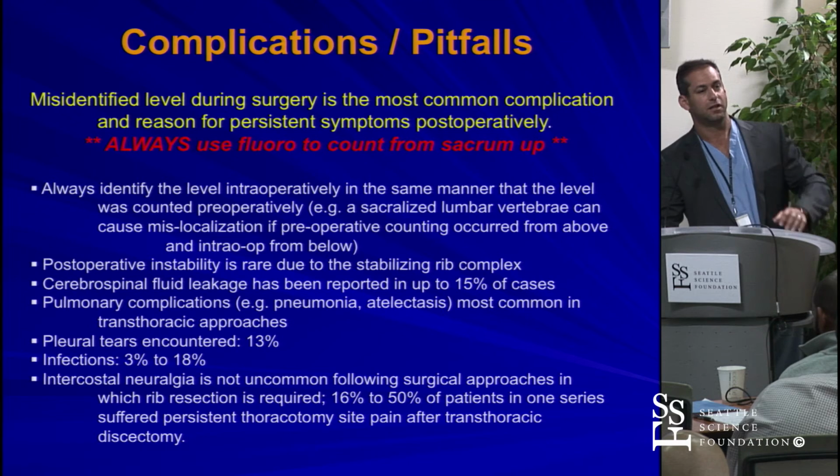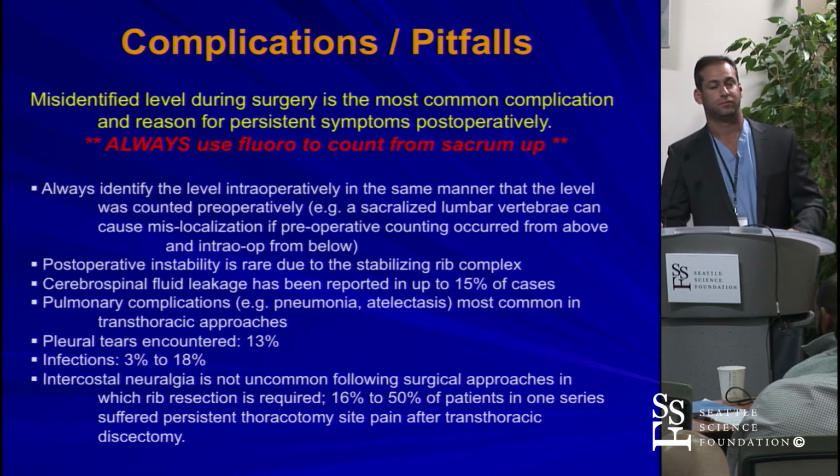The other thing is especially if I'm doing a posterior approach, once I've done a laminectomy, I'll use intra-op ultrasound, and that is an incredible tool to verify the disc and its imaging appearance and compression of the spinal cord.